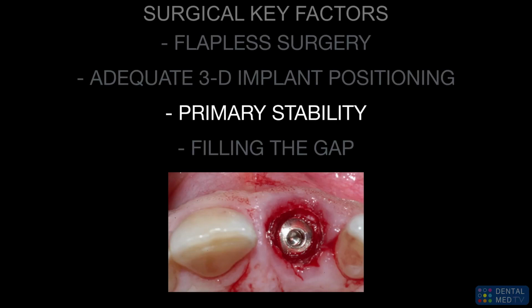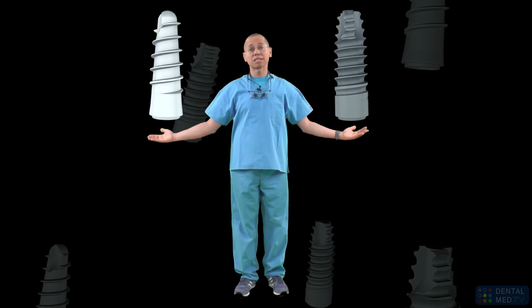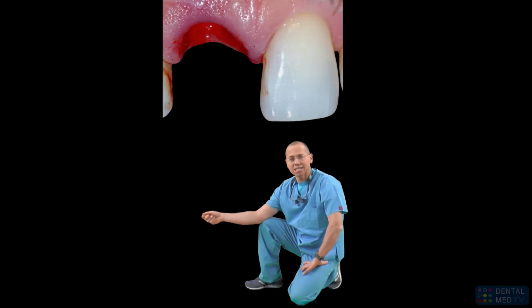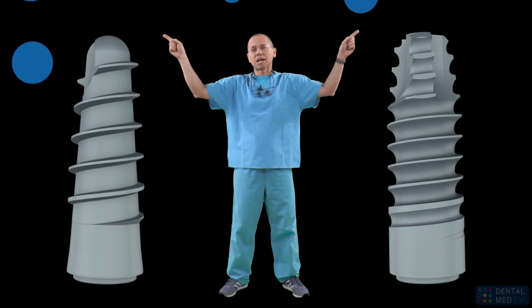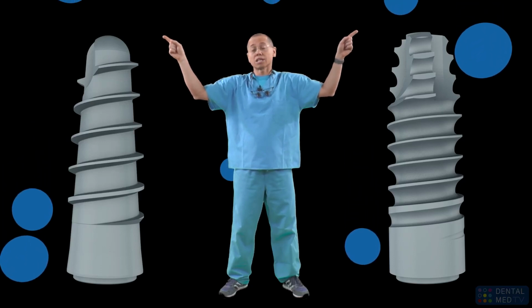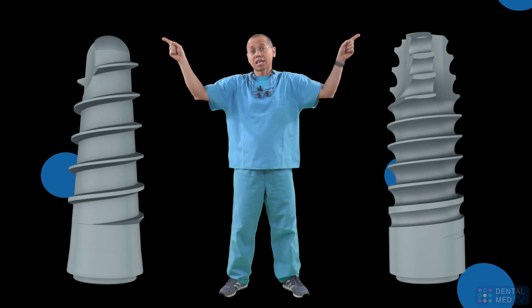But absolutely the most important key factor when we have to immediately restore an implant placed in a fresh extraction socket is to get proper primary stability. And in order to achieve such optimal primary stability, the implant design will be very helpful. Very different will be the primary stability achieved only in this apical portion when a tapered implant is inserted instead of a cylindrical one. At an equal vertical extent of primary bone-to-implant contact, the tapered implant will achieve by far a superior insertion torque due to its conical coupling with bone, therefore fulfilling at best the clinician's expectation in those challenging cases.